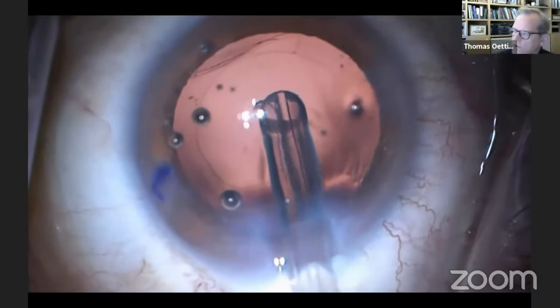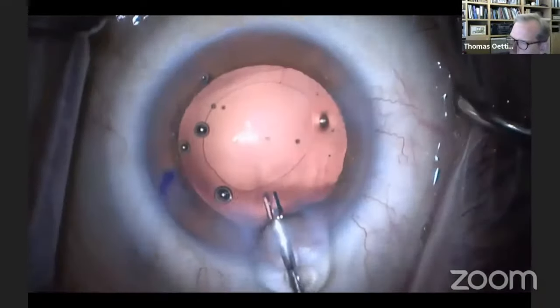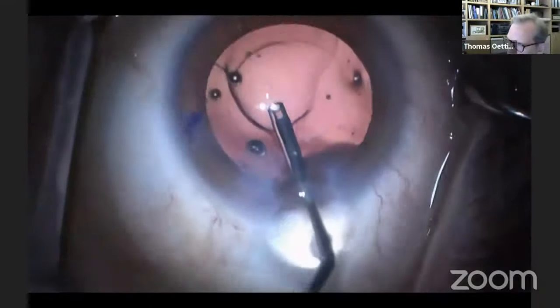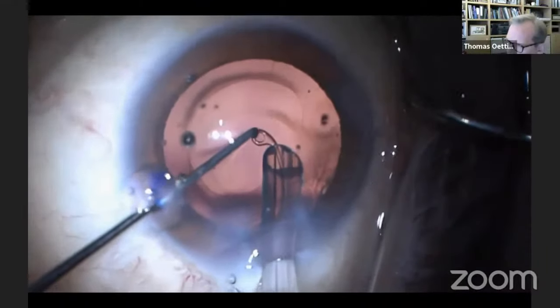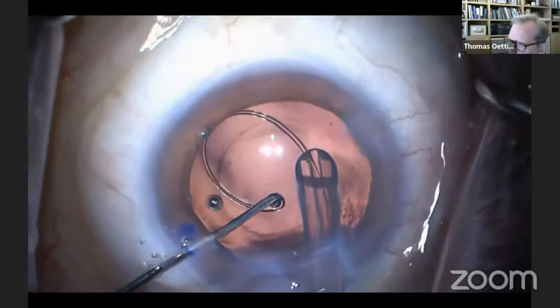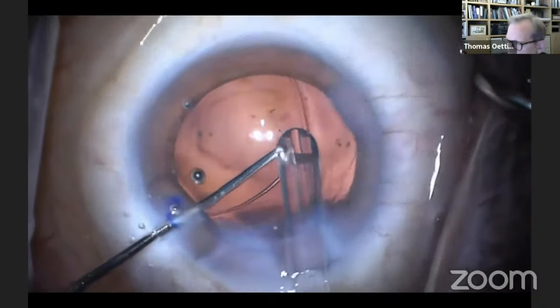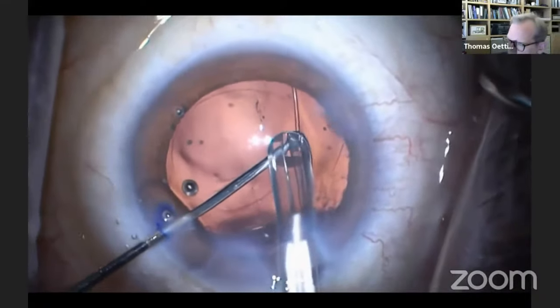Look at how the zonules are actually weaker right across from the incision. So now we're going to do the exact same thing, but we're going to use this Sinskey guided technique. And you can see how just by guiding the capsular tension ring with a Sinskey hook, how much more gentle the insertion is in this exact same case.